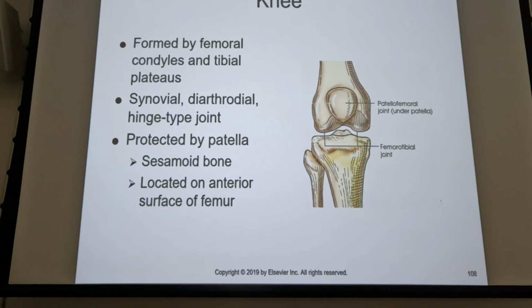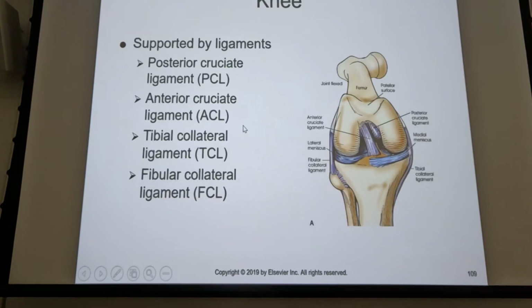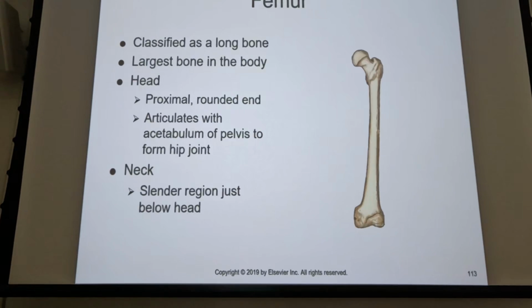And then we've got the patella being the biggest sesamoid bone in your body. The apex of the patella is at the bottom, okay? So you tend to think of mountains and things like that. The apex is at the top, but the apex of the patella is at the bottom. So our central ray positioning, if we're looking for the knee, is going to be just below the apex of the patella. The joint space between the femur and the patella would be the femoropatellar joint space. Mainly a hinge joint, patella, femur.